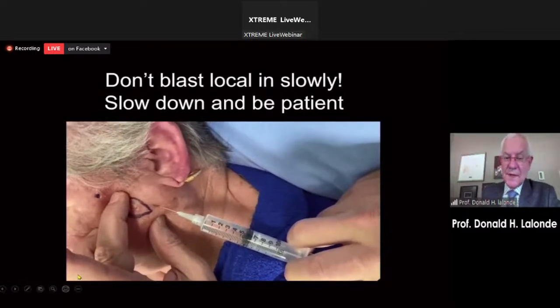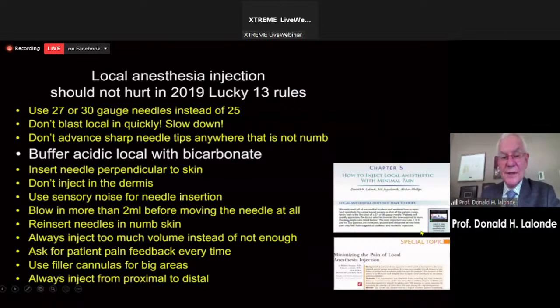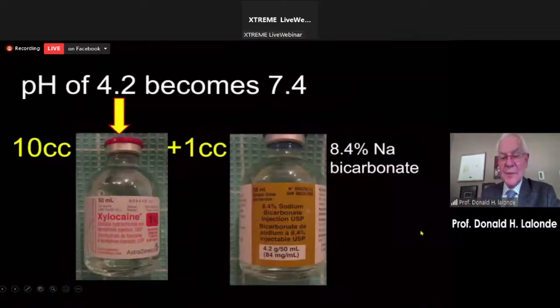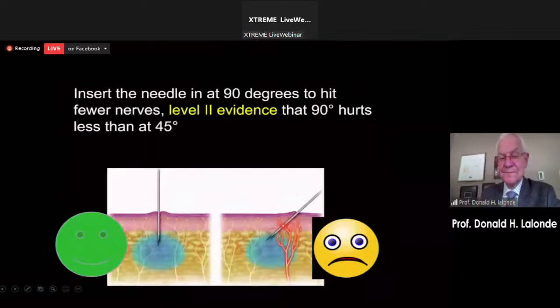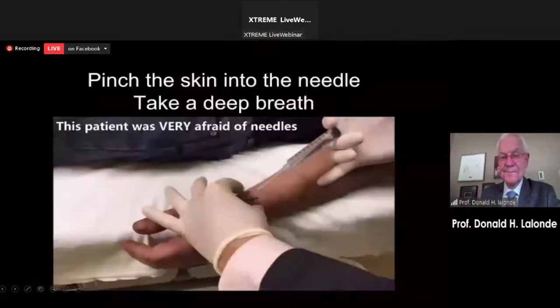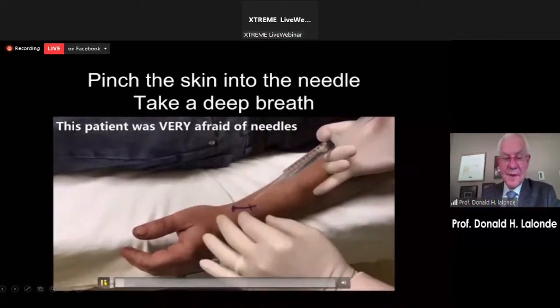Because if I just advance... So this video and all of these are in that paper, so I'm not going to stop at all of these. We're going to move past them because these are all in the paper that I just told you. This is the don't move rule. If you pull back, then the needle comes out. I have to stick it in two times. If you don't move, it hurts just one time, okay?